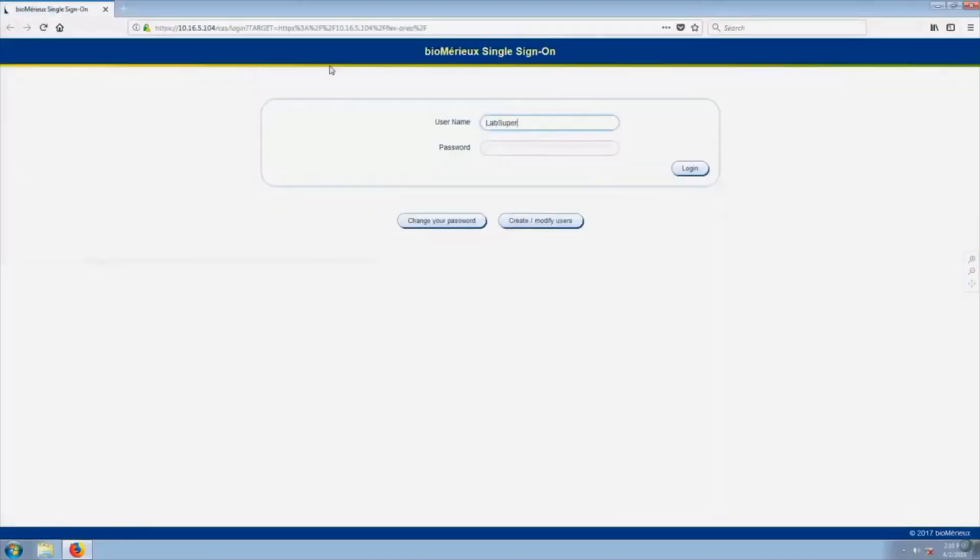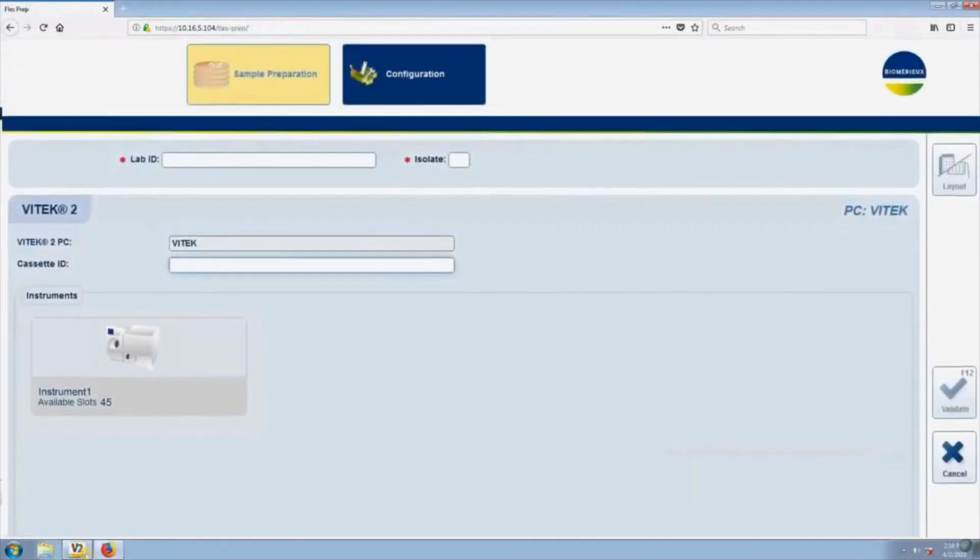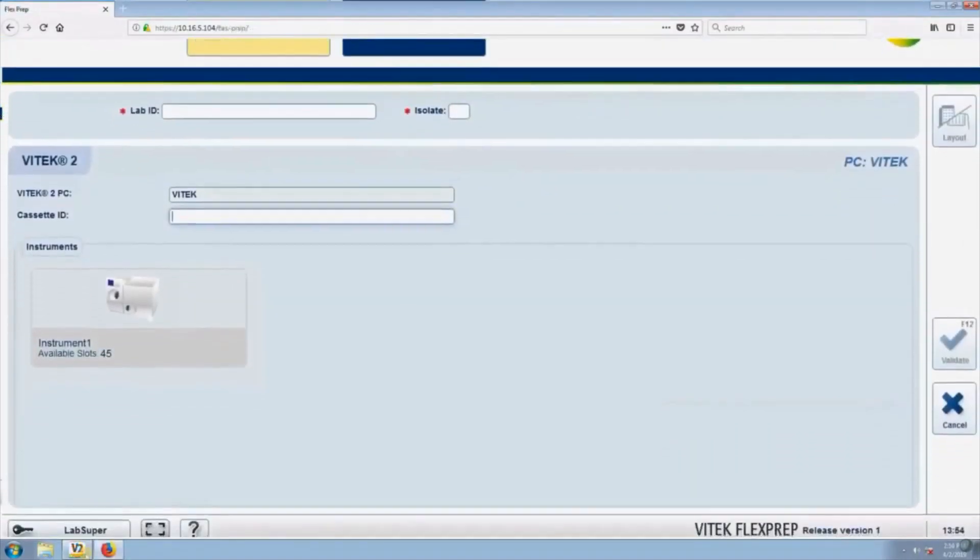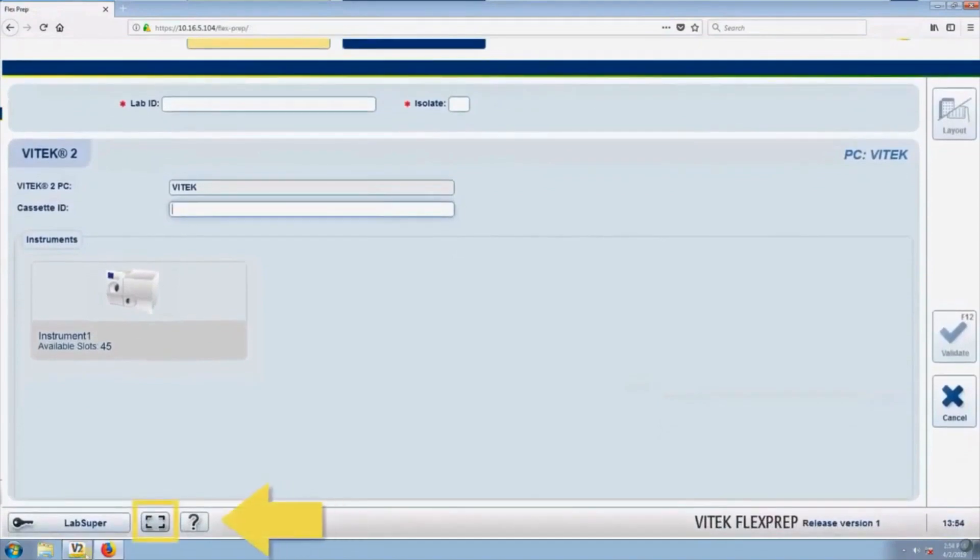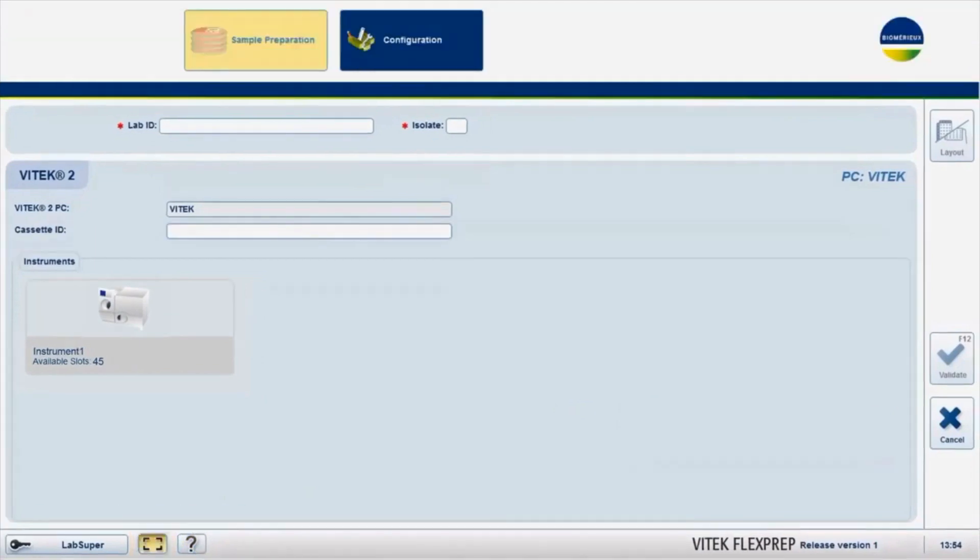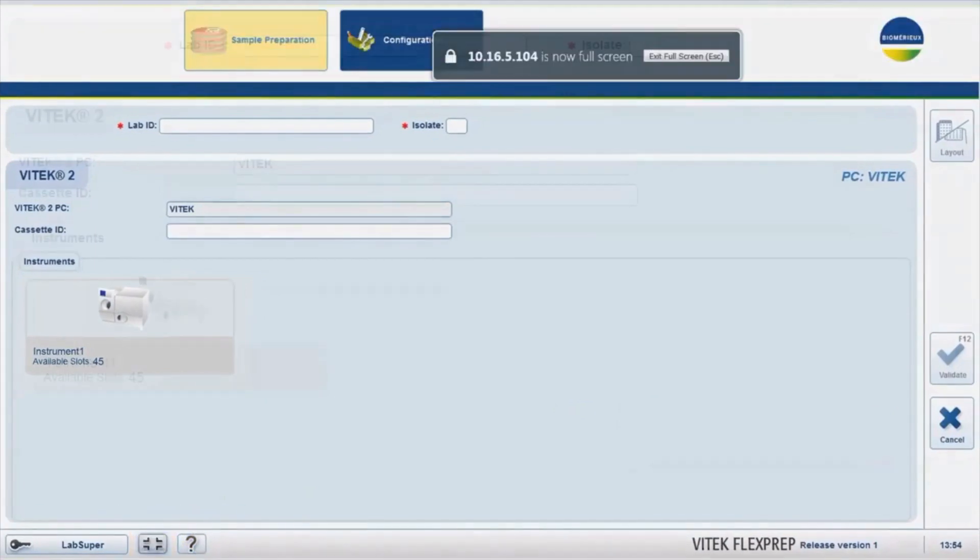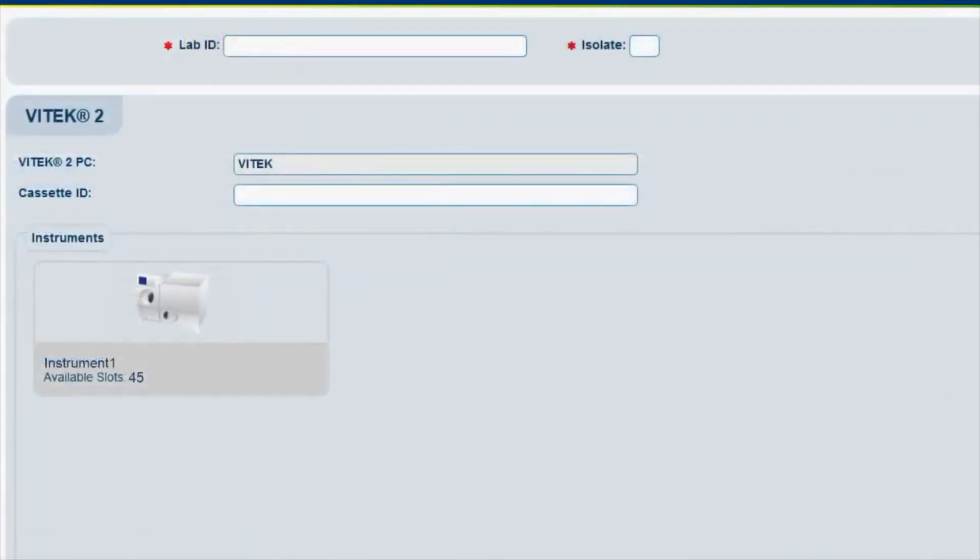By default, the sample preparation screen will display. Click on the To Fullscreen button every time that FlexPrep is launched. This is necessary for optimal screen display and workflow.